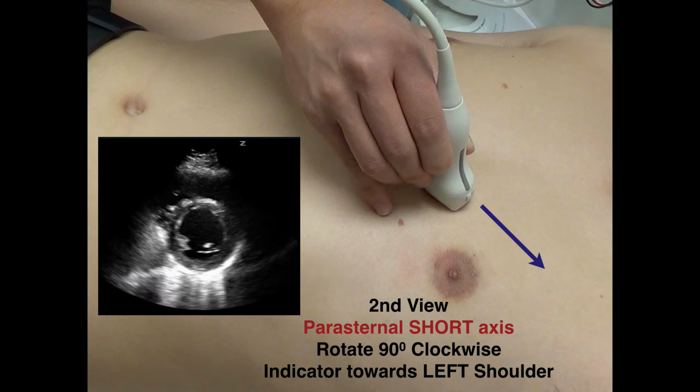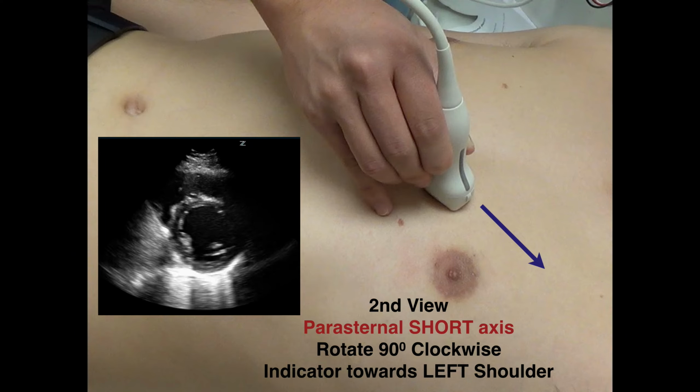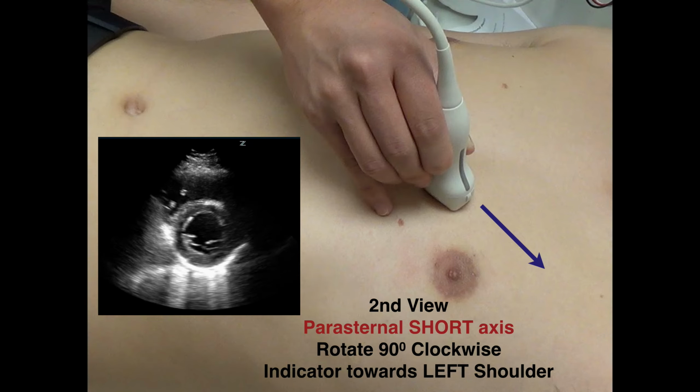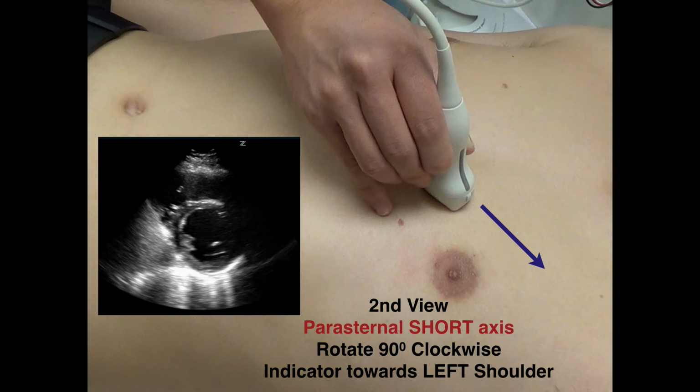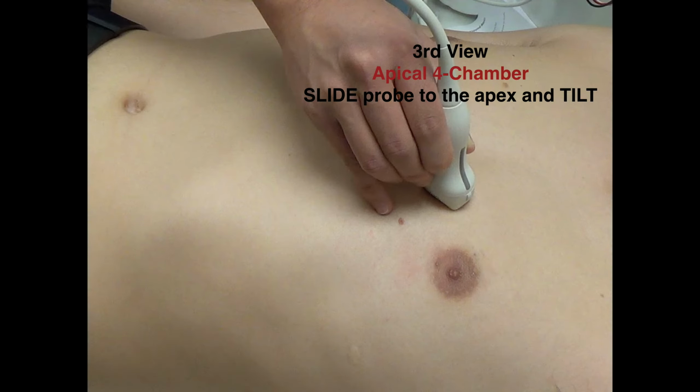Remember, you're looking for a nice circle. If you see anything other than a circle, like an egg shape or oval shape, then you know you're not at the correct axis. You have to tilt your probe a little bit to make sure it's a perfect circle, or as perfect as can be. So the third view is your apical four-chamber.